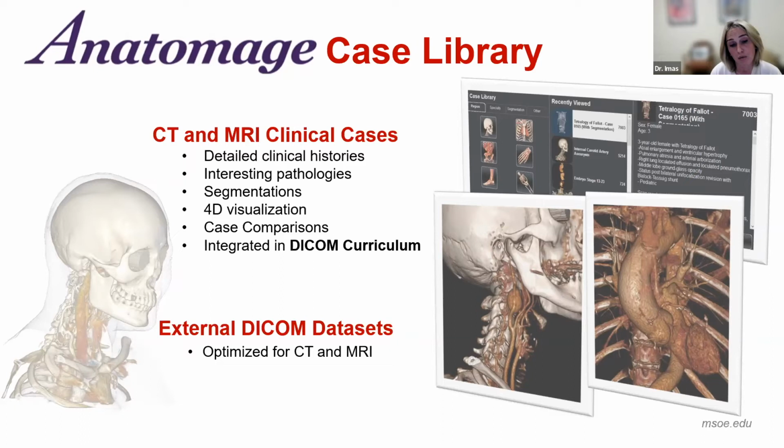These case libraries are further integrated in another tool within the Anatomage table known as the DICOM curriculum. This is where you get information that's very similar to the cadaver information, where structures are annotated and shown and highlighted, except here these structures are annotated and highlighted within a clinical image data set. I will show you a little bit about that. So this is essentially the anatomy presentation, but in medical images.